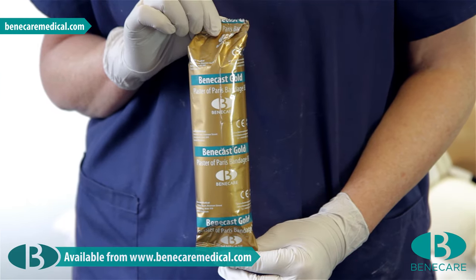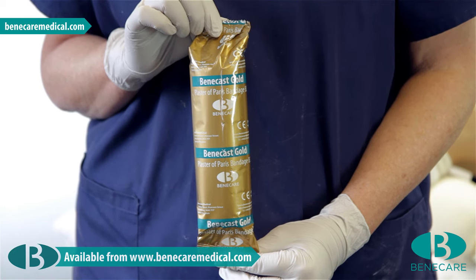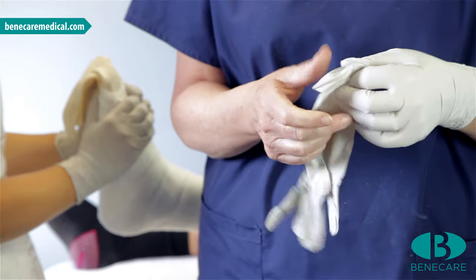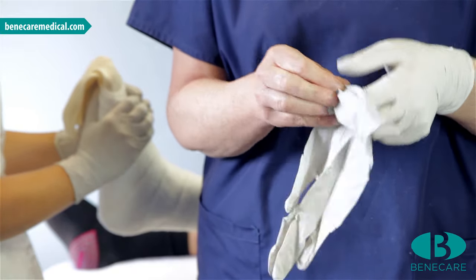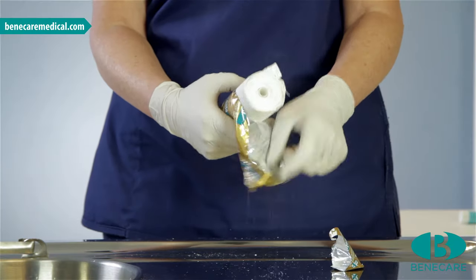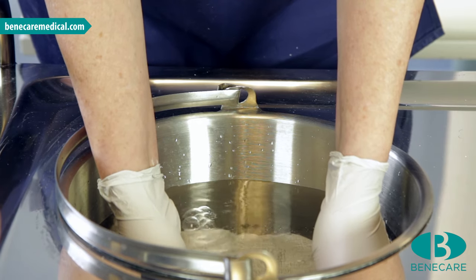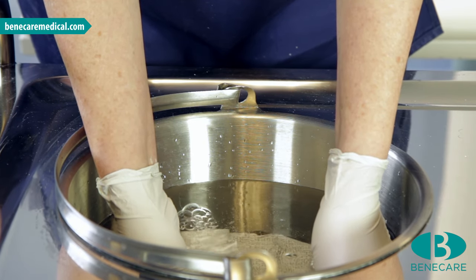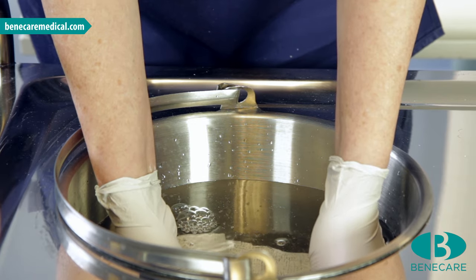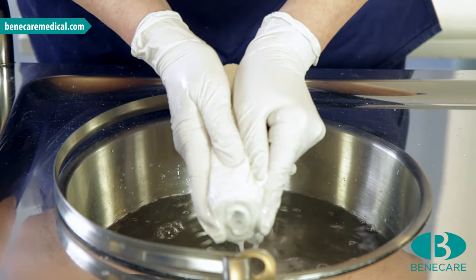The product of choice is the Benecast POP Gold. I will use 4 rolls of 15cm. If desired, apply examination gloves to prevent your hands from becoming dry. Remove the roll from the wrapping and immerse the roll into cool water until the bubbles disperse. Cooler water will provide a slower set time whilst room temperature water will decrease the set time. Give a moderate squeeze to remove the excess water.